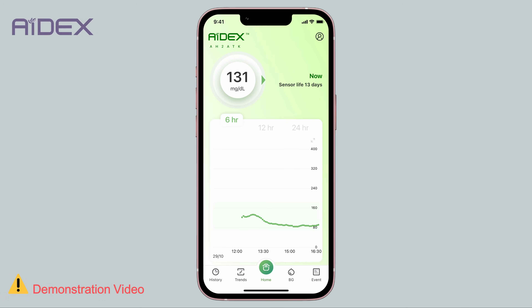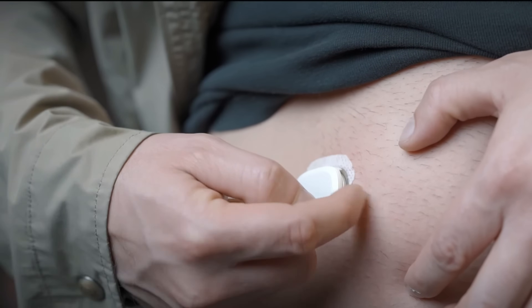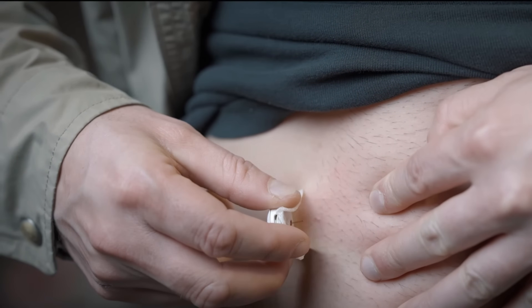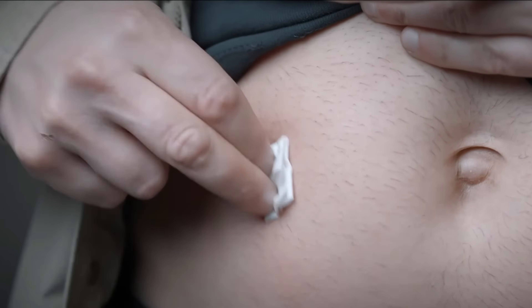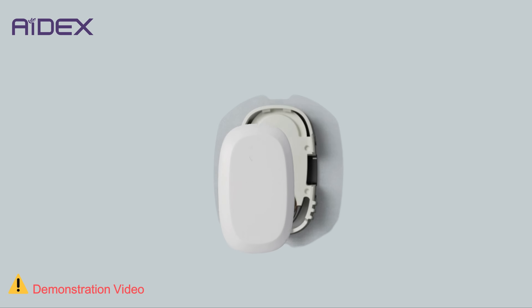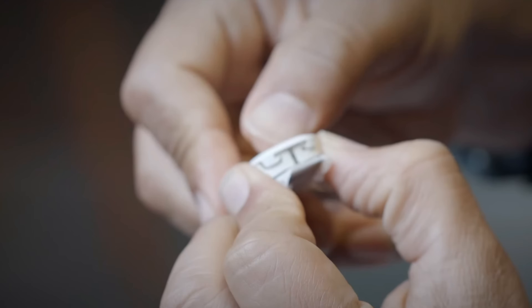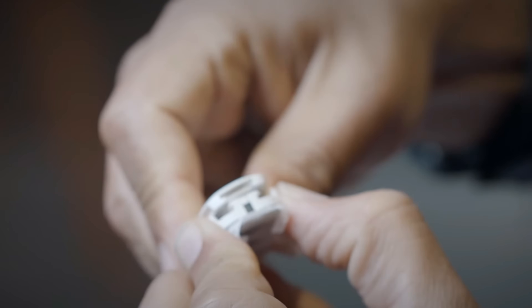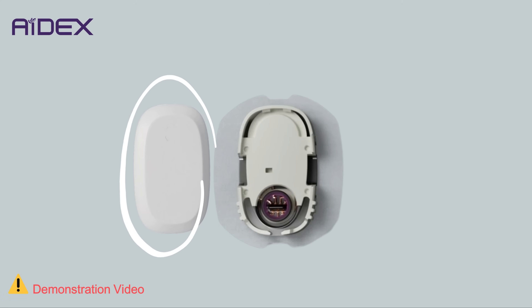After the sensor reaches the end of its useful life, you will need to replace it. To do so, lift the sensor gently from one side, then remove it completely. Clean the area where the sensor was attached. To detach the transmitter from the sensor, press the sensor from the sides as shown in the video, then lift the transmitter up. Ensure that you keep the same transmitter for use with a new sensor.